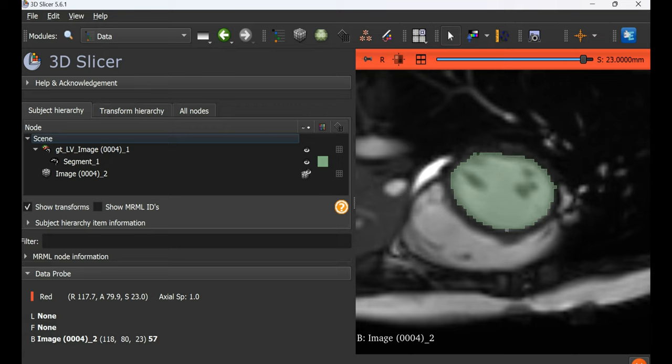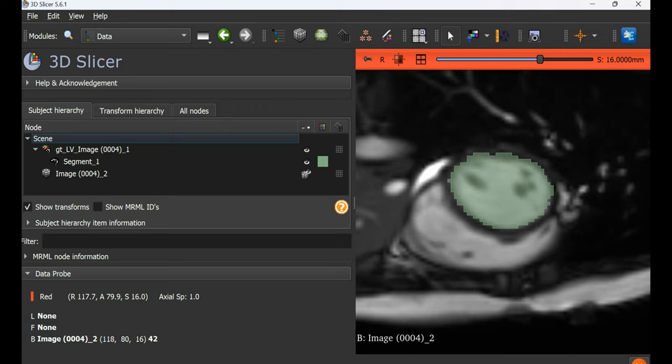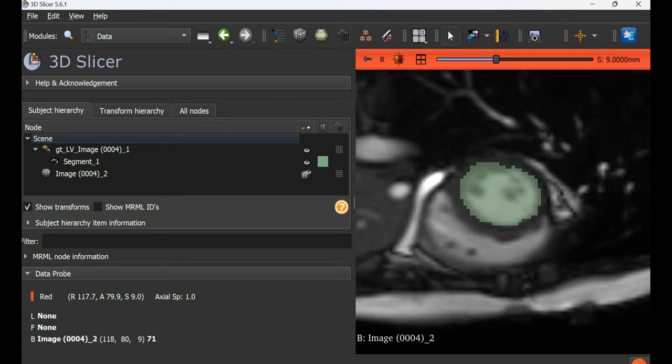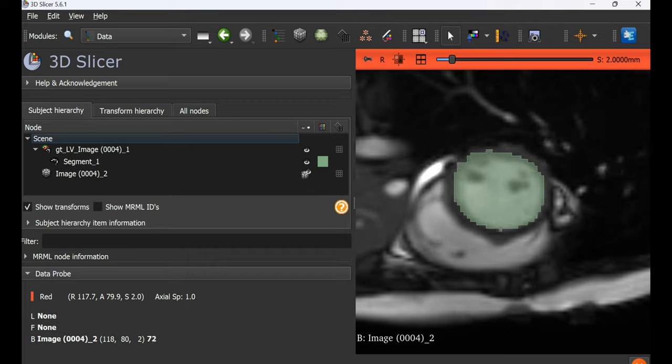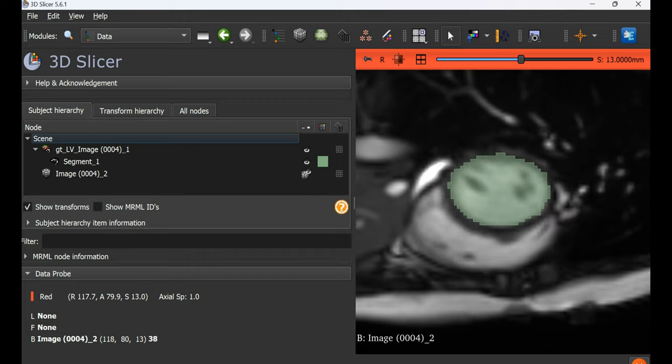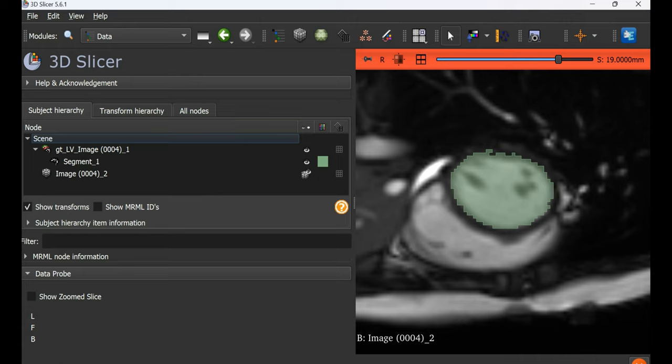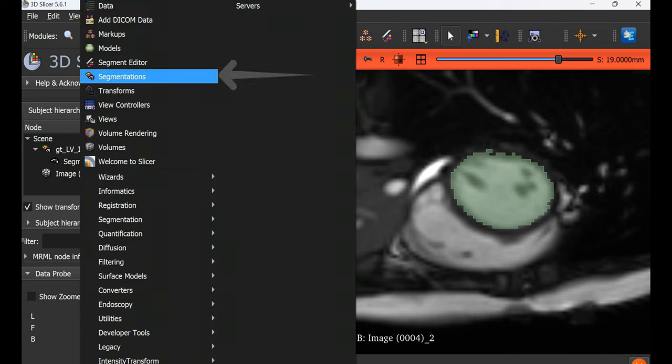Now we see that the masks are not correct or not smooth in some slices, so we need to edit these. We can do this in the segment editor directly, but before that we should set the transparency of the mask. This is not necessary but it helps while editing.